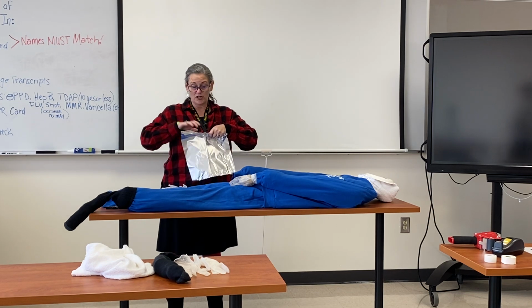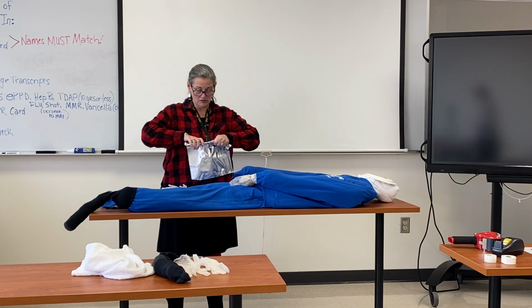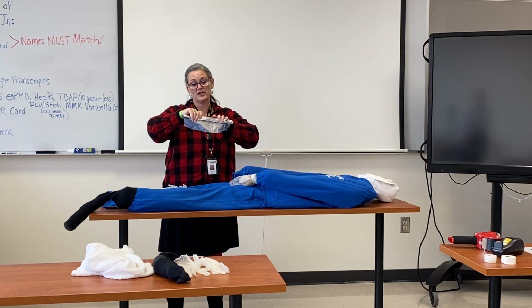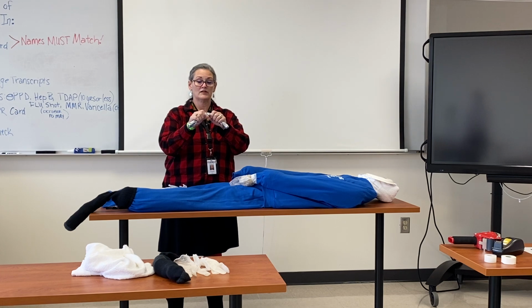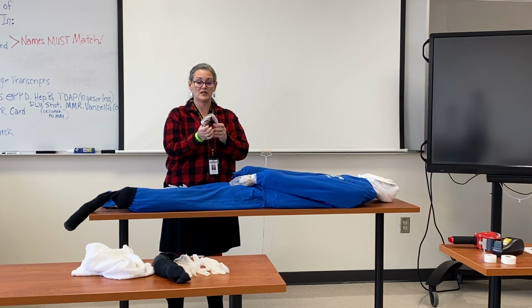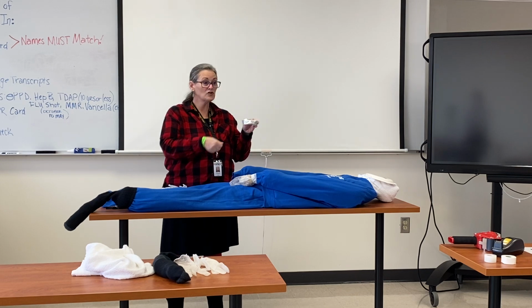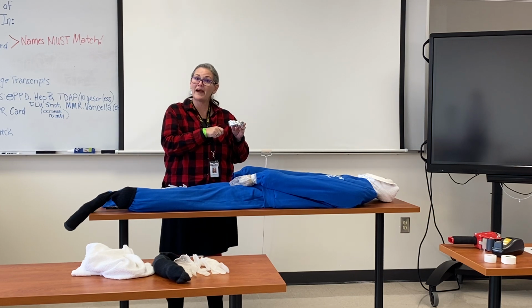But basically all you're gonna do is take the aluminum foil, you're gonna roll it in a tube, just like this, shape it into a set of teeth. Look at there, you got a set of teeth. Now you can pretend to brush the teeth to do mouth care.